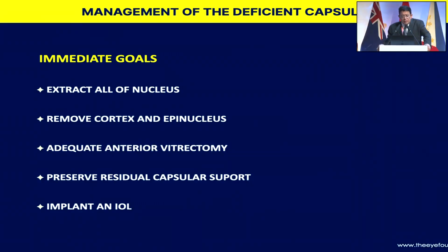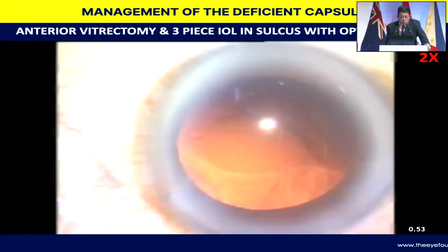It's most important that you do not damage the eye irretrievably. And just in case a significant amount of nucleus or lens matter has dropped into the vitreous cavity, it's better to enlist the support of a posterior segment colleague. So let's look at these bunch of videos.